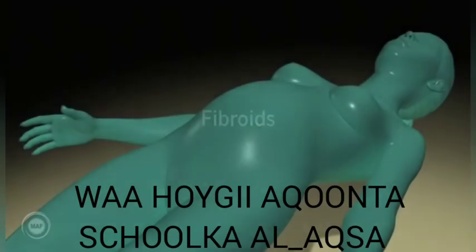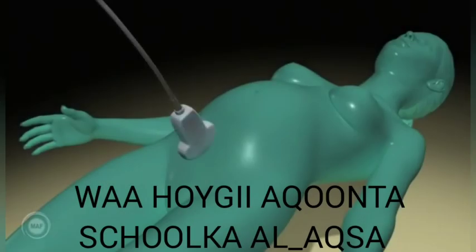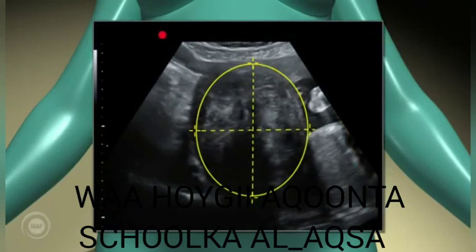Fibroids. When scanning fibroids, it's important to describe their size in terms of volume. Two measurements are taken in the longitudinal plane, and one measurement is taken in the transverse plane.